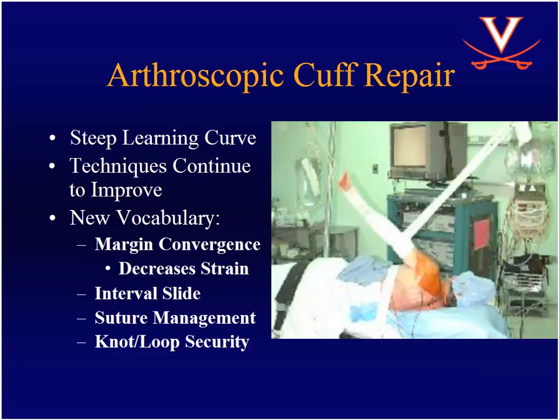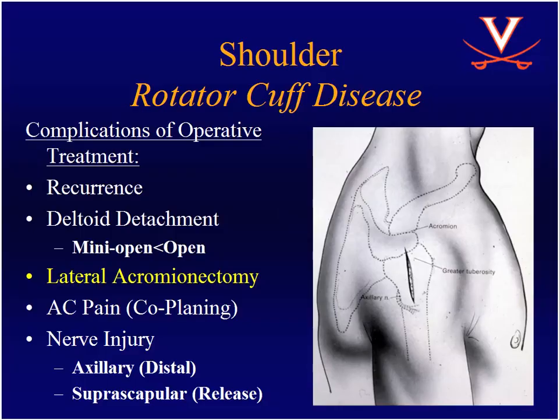Interval slides in order to get some release so you can mobilize the cuff. Suture management, if you've ever been involved in cases with 15 sutures coming out of portals and you have no idea what they are, we understand the concept of using different colored sutures and managing the sutures. Knot or loop security, in other words, making sure your knots get tied down with a slip knot followed by half hitches. And so it's been a whole new learning curve for all of us.